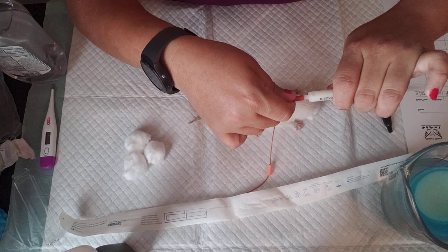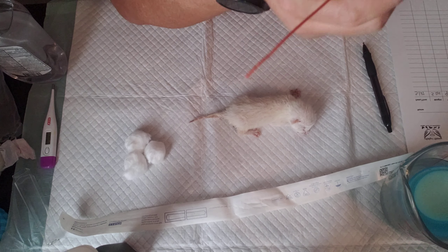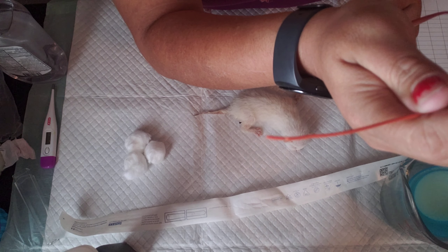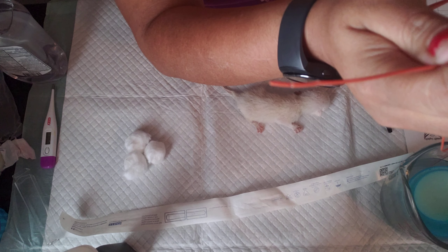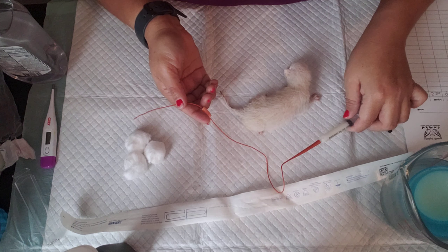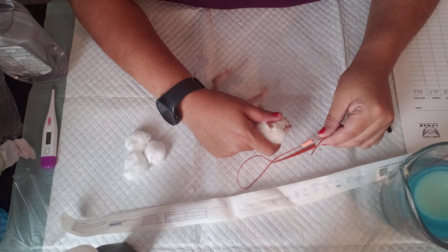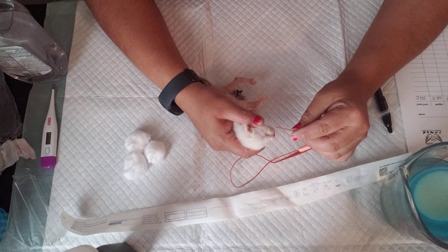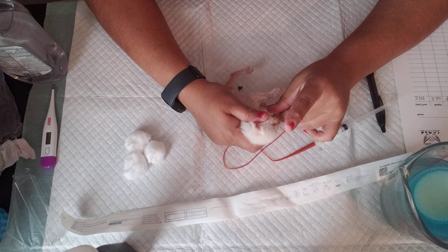Now we're going to push this catheter on there, and you want to push it until you see the milk drip. You certainly don't want to get air in there. I always lay them on their side — just go in from the side, real gentle. They'll swallow.